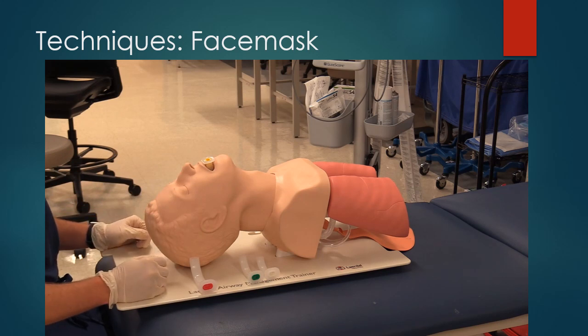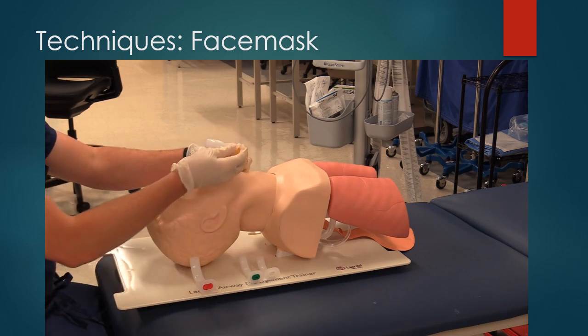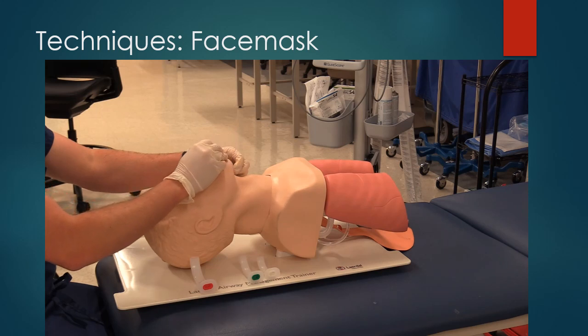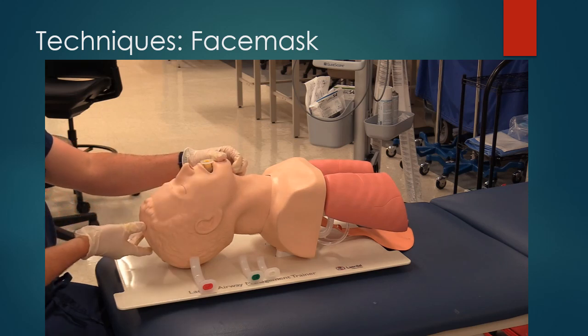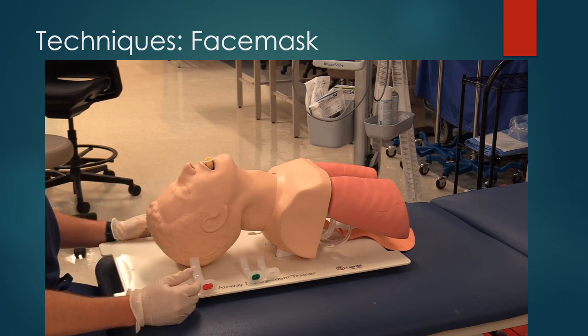The last technique would be to just insert it without any rotation, although this one frequently will run into the tongue a little bit faster and will sometimes get hung up as the tongue pushes towards the back of the mouth. If one technique doesn't work, keep trying different ones and make sure that you have the proper size when doing this. Following insertion, you can resume bag mask ventilation.